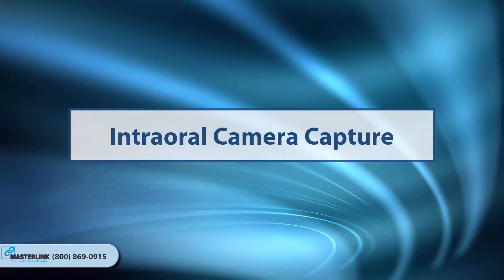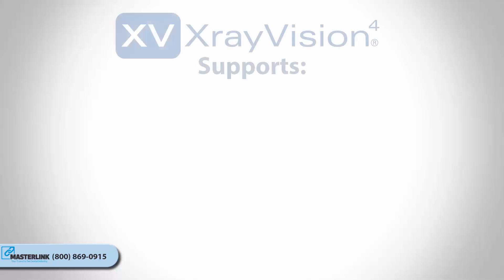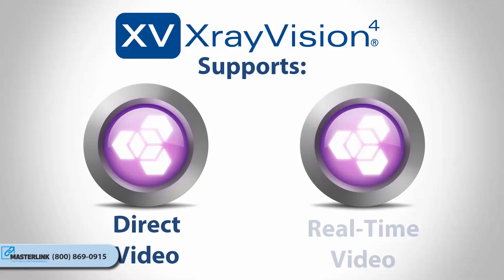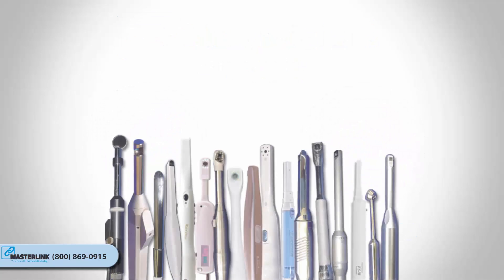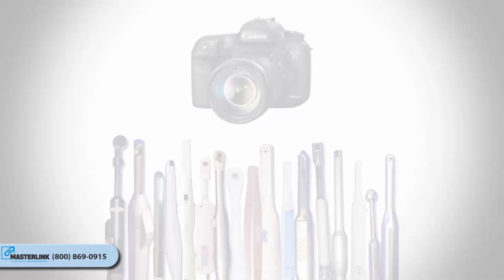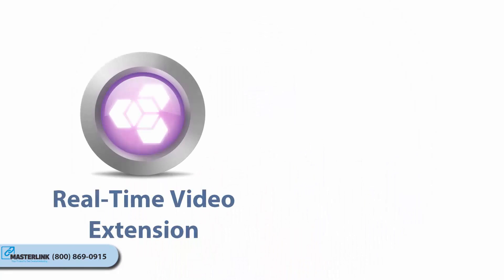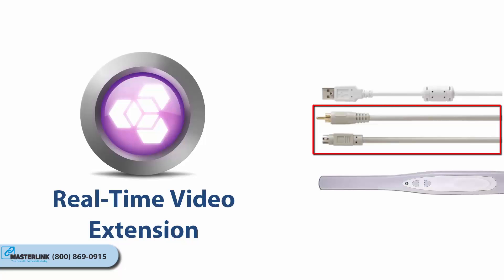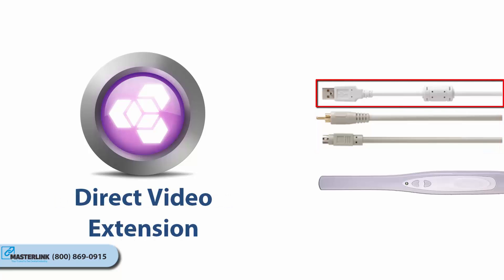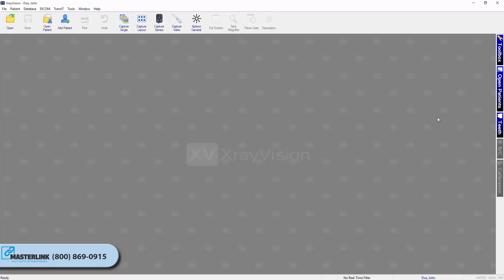Intraoral Camera Capture. X-Ray Vision offers an easy-to-use direct video and real-time interface that allows users to capture live images from video sources such as intraoral and digital cameras. The real-time video extension is used for capturing images from older analog intraoral video cameras connected to computers via video capture card. The direct video extension is more commonly used for recent technology that connects cameras via USB, Firewire cameras, and DirectX video capture cards. In this video tutorial, captures will be limited to capturing from an intraoral camera with the more commonly used direct video extension.